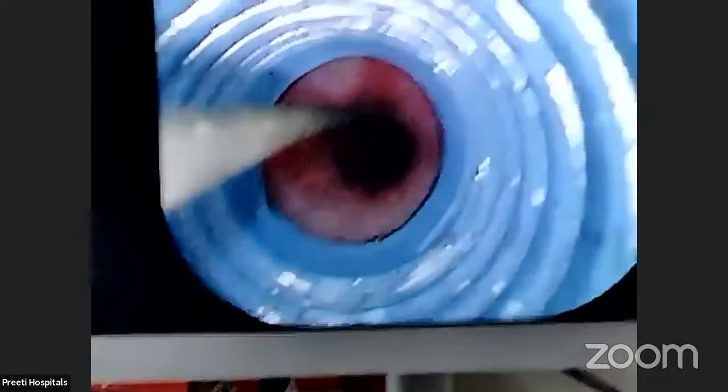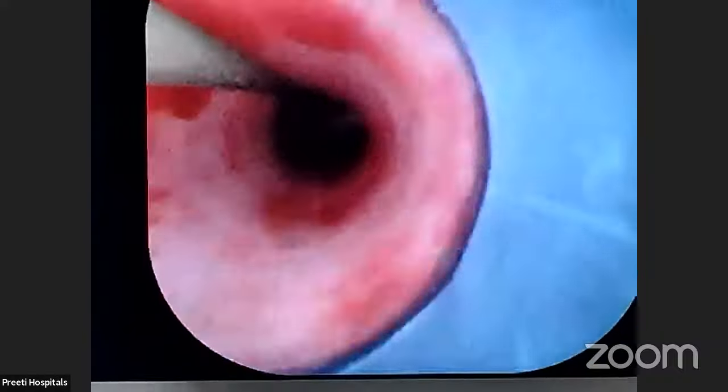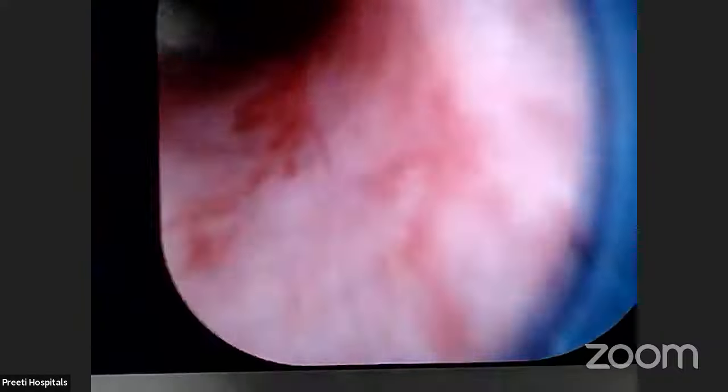Capillaries are seen. Erythema will be expected in post-stented cases. Nicely the ureter is seen. No graze. Nothing. I have come out. See, the guide wire is there. I will keep only that. I am taking it out. And only the guide wire is left behind, and not even a ureter catheter. Why? It's only the spasm of the ureter, which has to be left open.